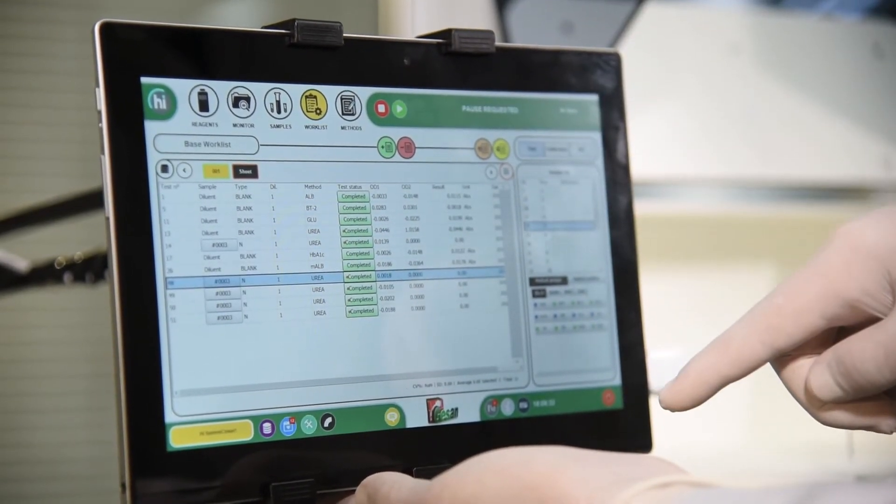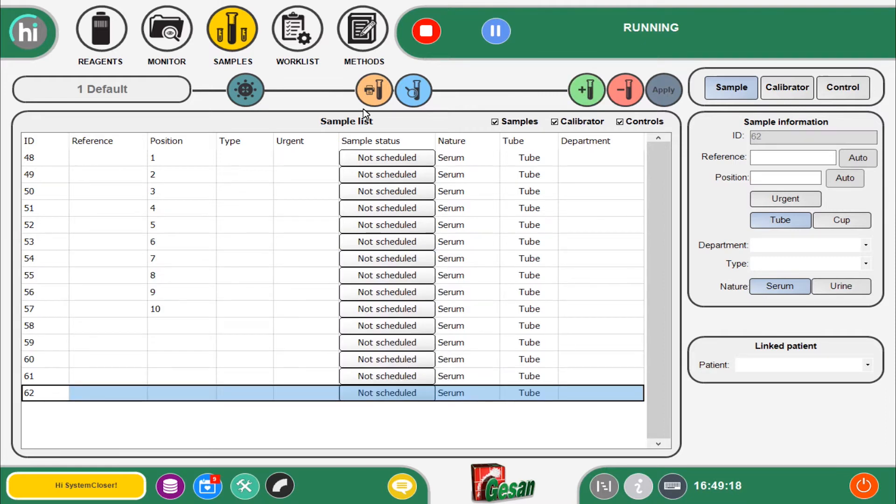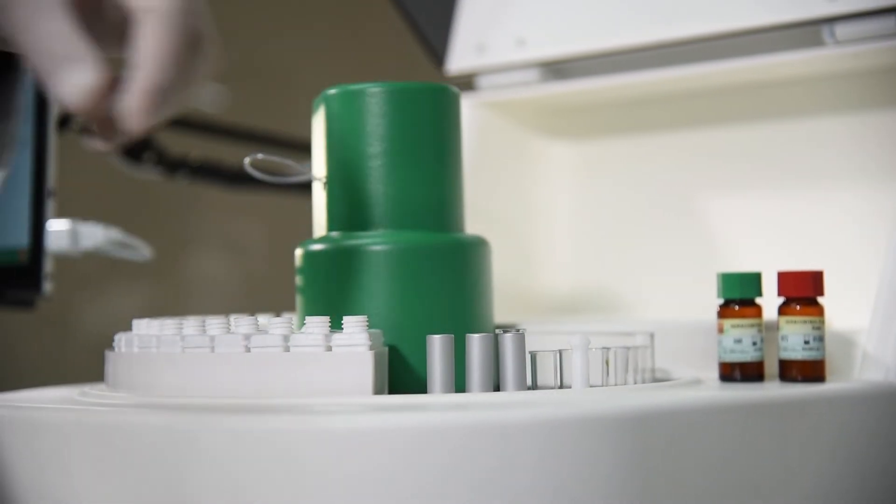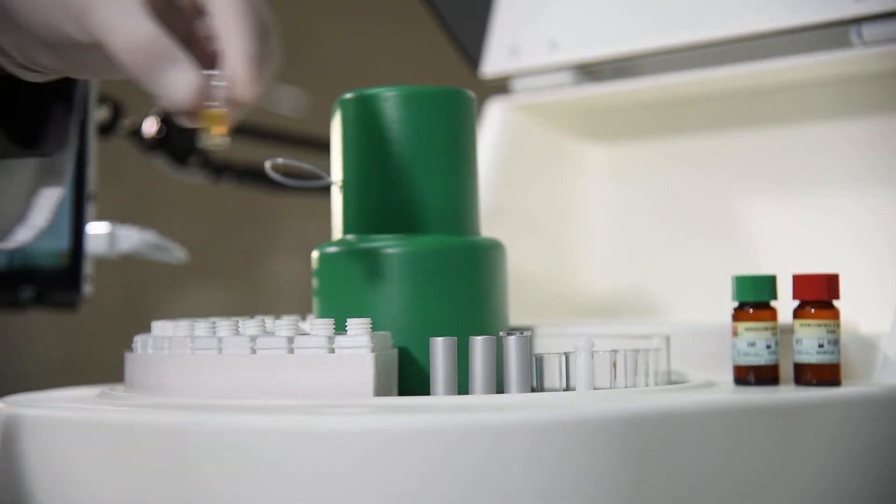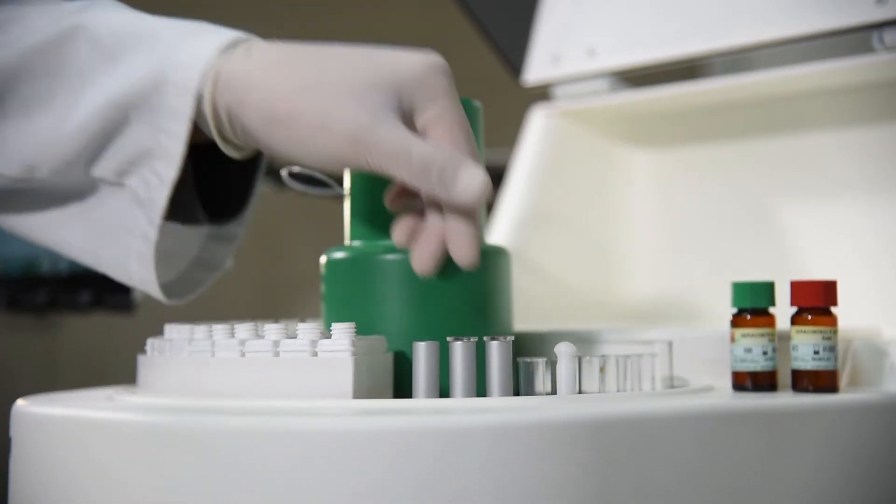The loading of calibrators and controls is easy as well, by recalling the related identification code from the list and adding it on board in any free position of the sample rack.